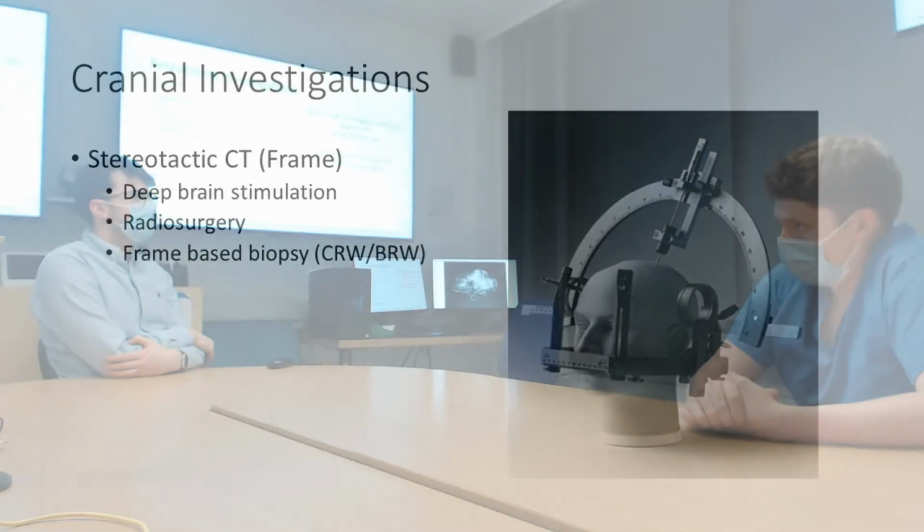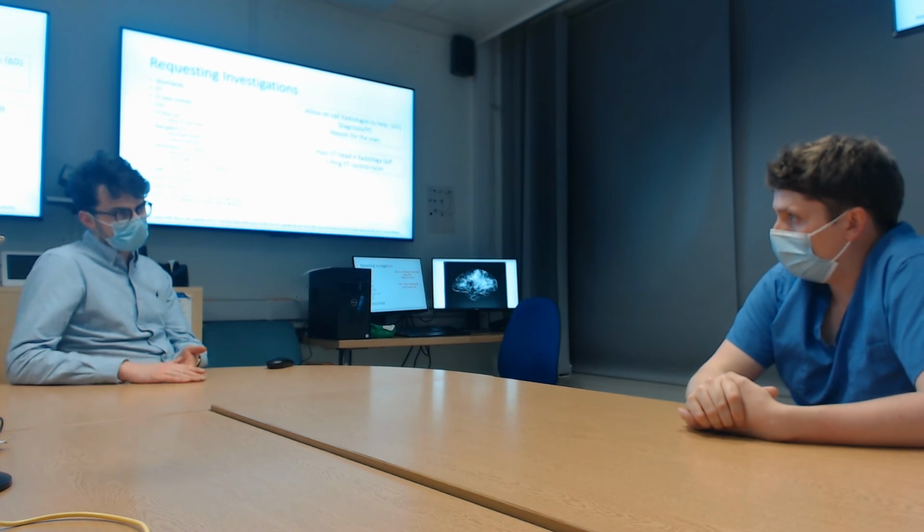Okay. And then I guess the other scan that we do a lot here is MRI. Yes. You do it with or without contrast?